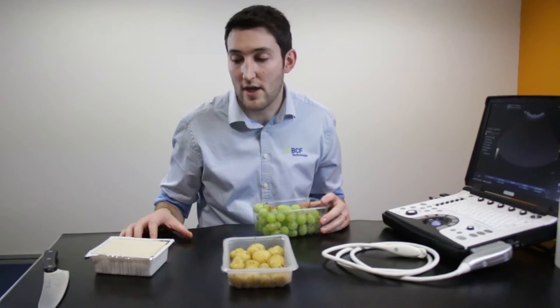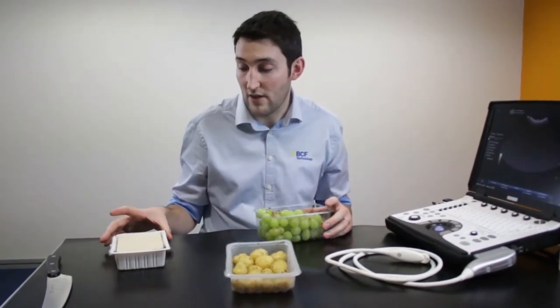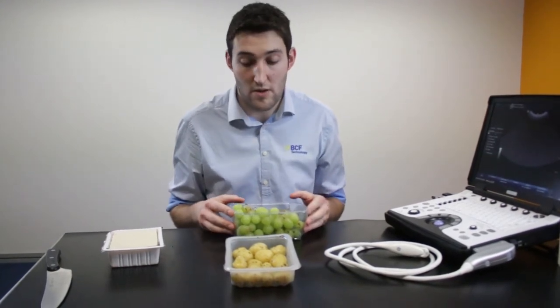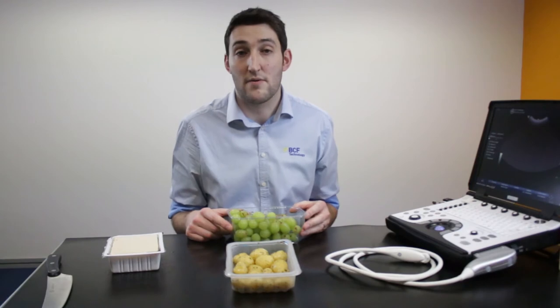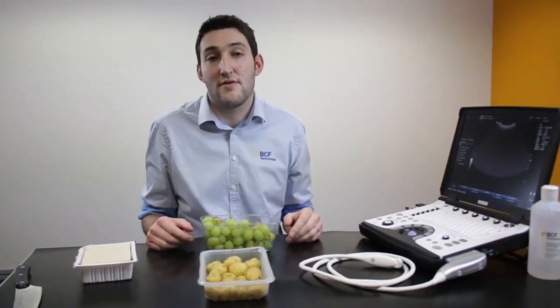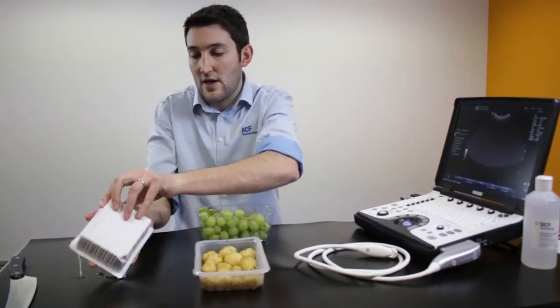Just a quick trip to the supermarket — pick up some fresh tofu in its tray, and then really anything that you want to stick in. We've got some grapes here and also some boiled potatoes. If you're going to use potatoes, it's worth boiling them — it doesn't work very well if you don't. You can also try different things: olives, raspberries, whatever you want to tuck in, really, just to provide a target to aim for.